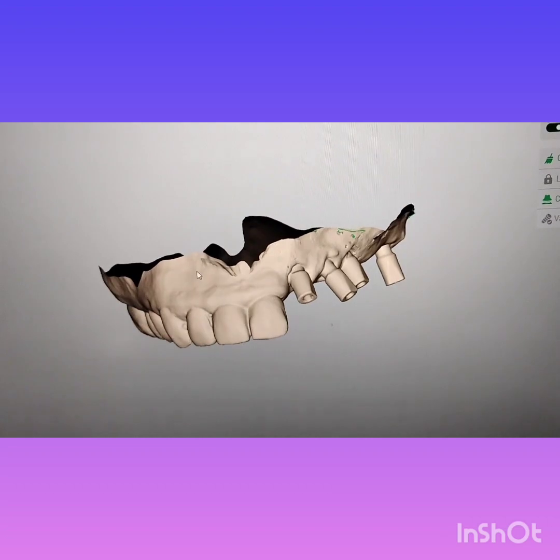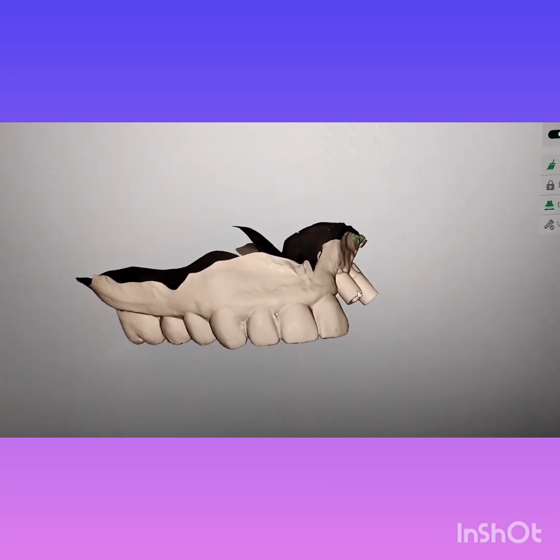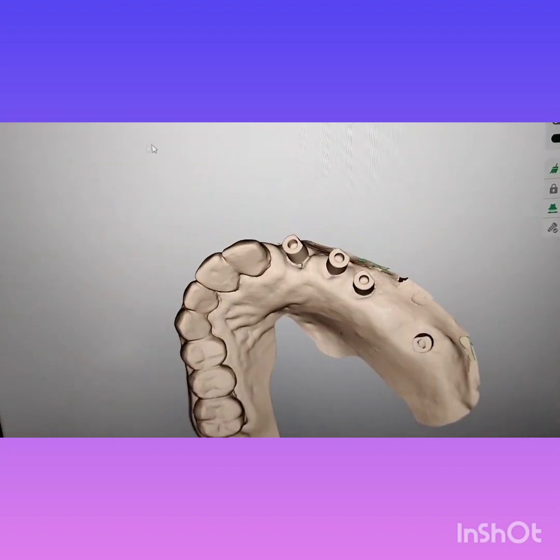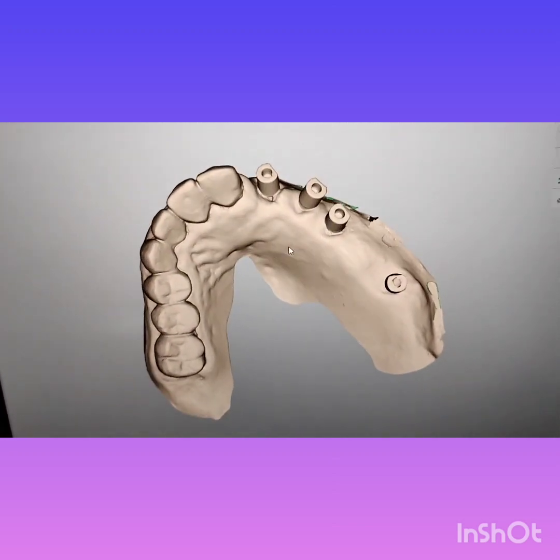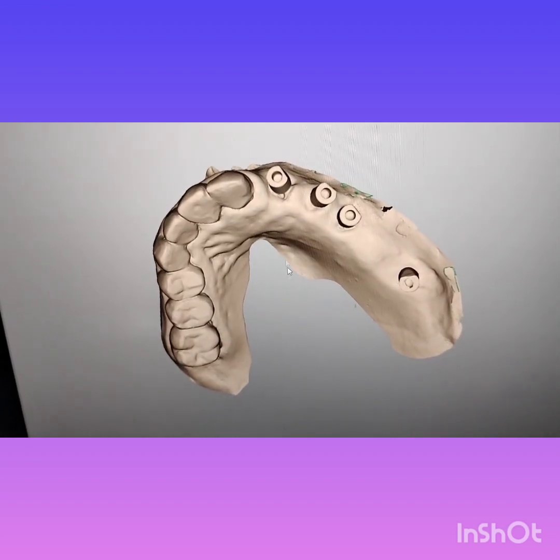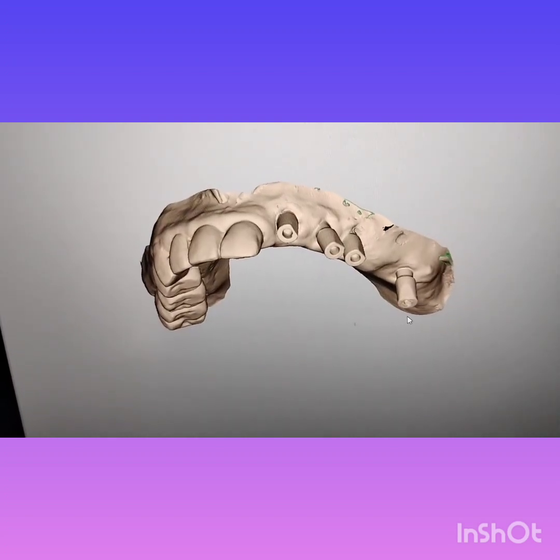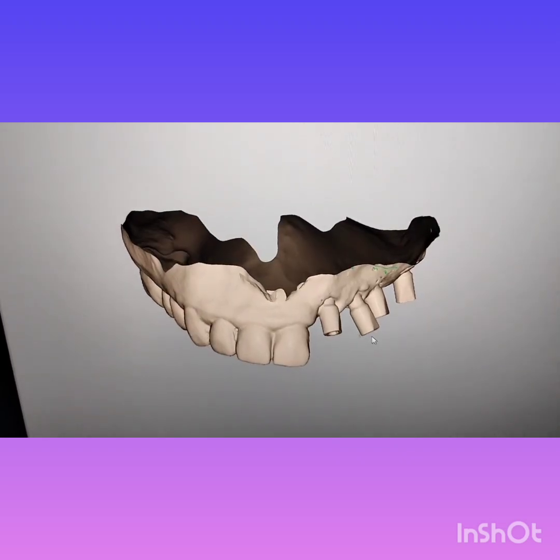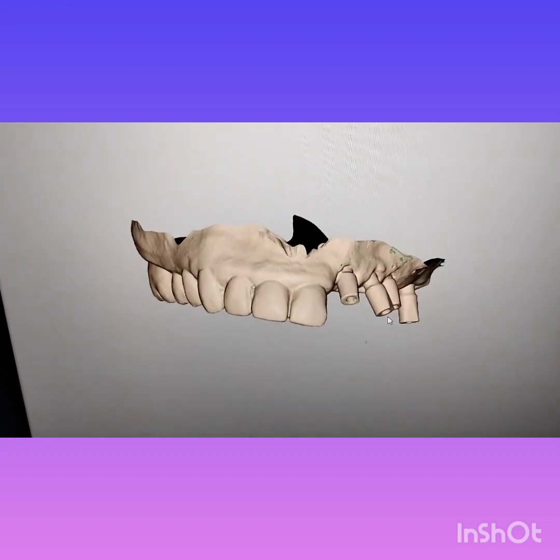If you see these angulations, they are outwardly placed. This is how they have been placed. On the intraoral scanning of this patient, you can appreciate the positions of these implants. Some implants are pretty straight, but this angulation is difficult and prosthetically becomes challenging to manage when fabricating fixed partial dentures.